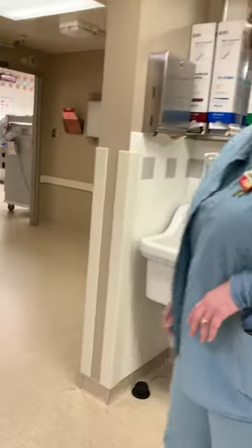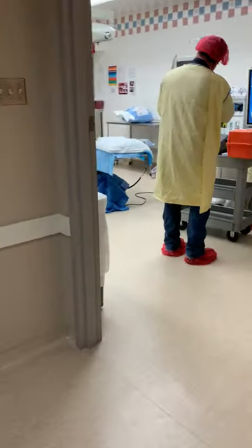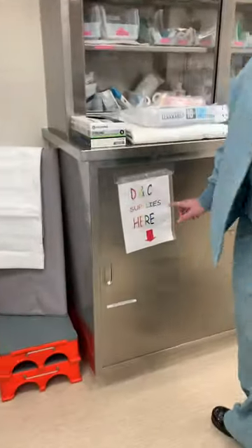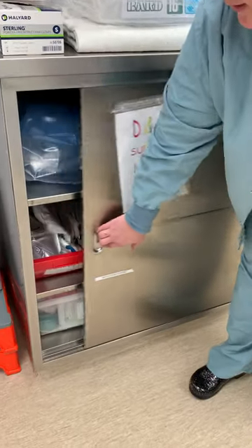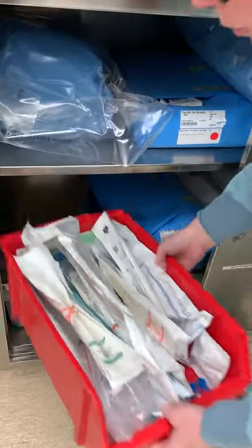Now let's go look at those curettes — where are they located? Your cabinet that says 'DNC supplies' — your curettes are right in this red bin.